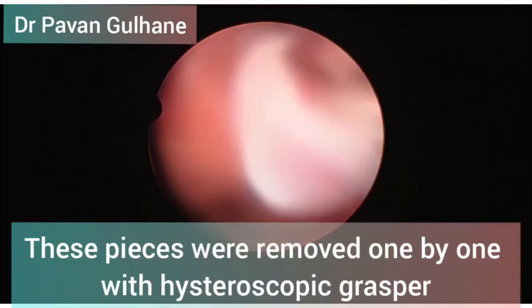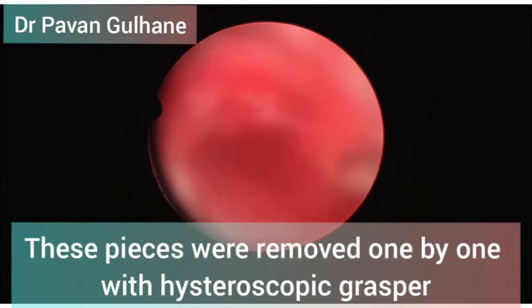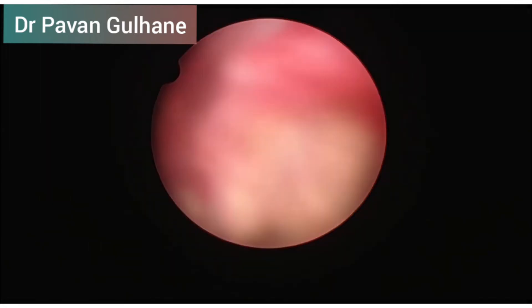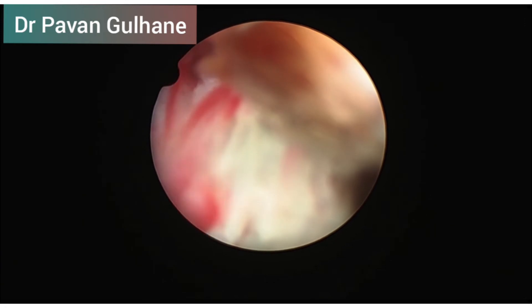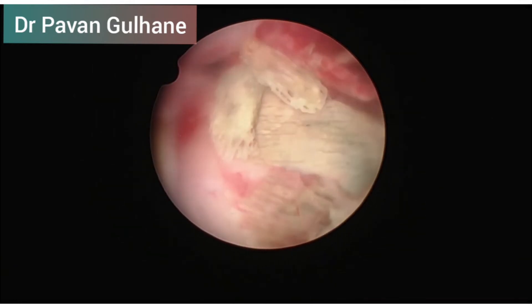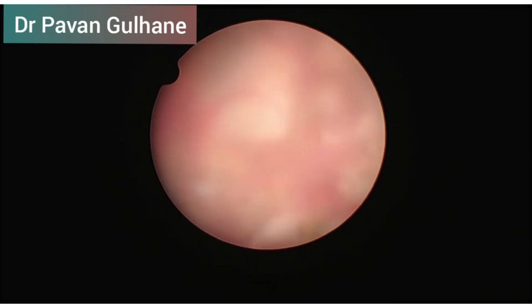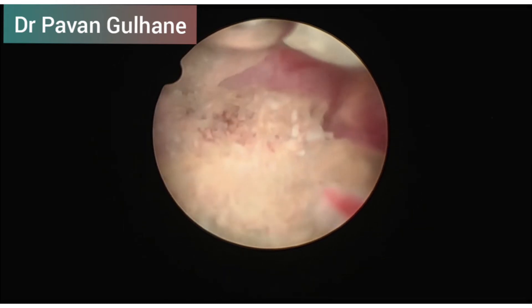In osseous metaplasia there can be a varying extent of the endometrium covered with bone. In this case, as you notice, the entire endometrium was totally covered with bony pieces. Diagnosis of these patients is most likely done on ultrasonography where you notice hyperechogenic, irregular foci in the endometrial cavity. These patients generally present with hypomenorrhea, infertility, and chronic pelvic pain, most likely occurring after a history of previous abortion.